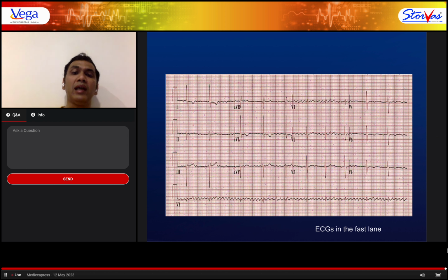So when you see an arrhythmia like an atrial fibrillation where P waves are not consistent or do not look the same, and there is no isoelectric baseline, but the conduction to the ventricle remains consistent, stone cold consistent, that is suggestive of an AV nodal block in the presence of atrial fibrillation.